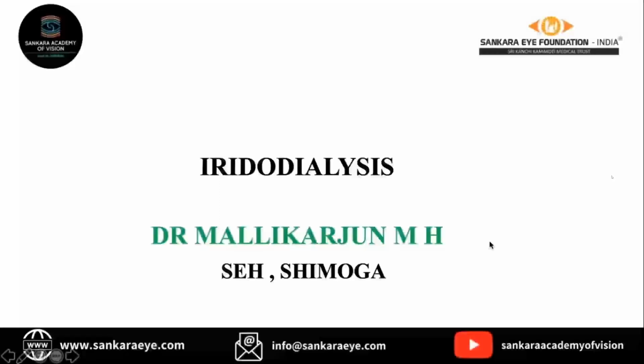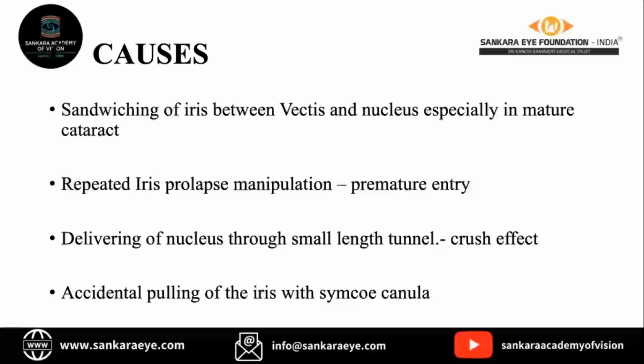Hi everyone, I am going to talk on iridodialysis causes, prevention and management in the SICS. Most commonly it happens during nucleus delivery. When you engage the nucleus along with the iris and pull it out, it may lead to iridodialysis. And if you have a premature entry and there is iris prolapse, repeated manipulation might lead to iridodialysis. And the delivery of nucleus through a small tunnel.